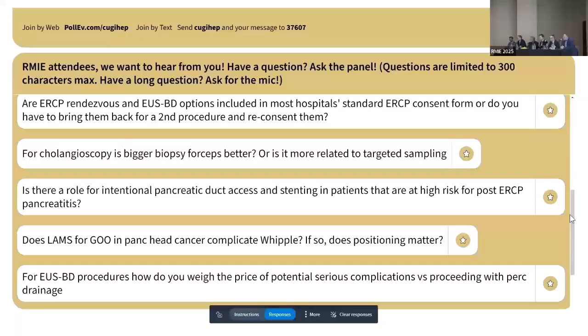Again, because I do both, I end up frustrating myself. So the bottom line is that, in the perfect world, we should be documenting it. The reality is that, number one, your bowel, outside of peristalsis, the lengths are very different to the lengths when you've got a functional bowel with peristalsis. Number two, as soon as you do alter the anatomy, the limb length naturally, through gravity, elongates, not much, but it does get longer.